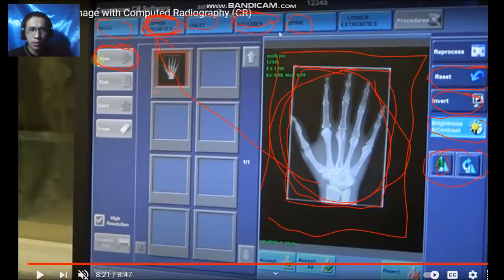Okay, so you have the scanning button, and in the middle of the scanning, if you want to stop, then you can stop. You can stop, and then you can also eject. There are buttons in the monitor with which we can safely eject the imaging plate or the cassette for the imaging plate.